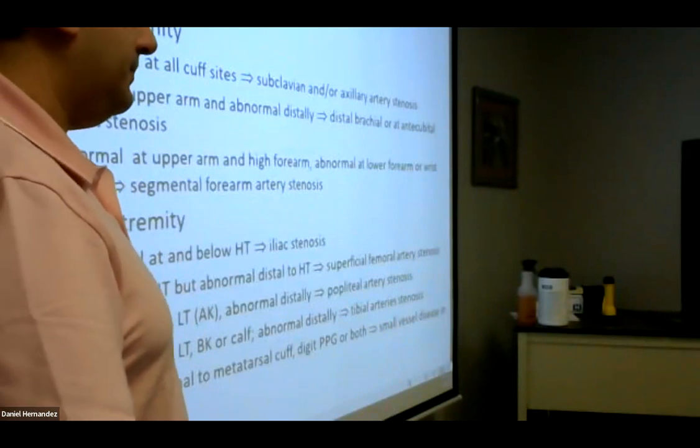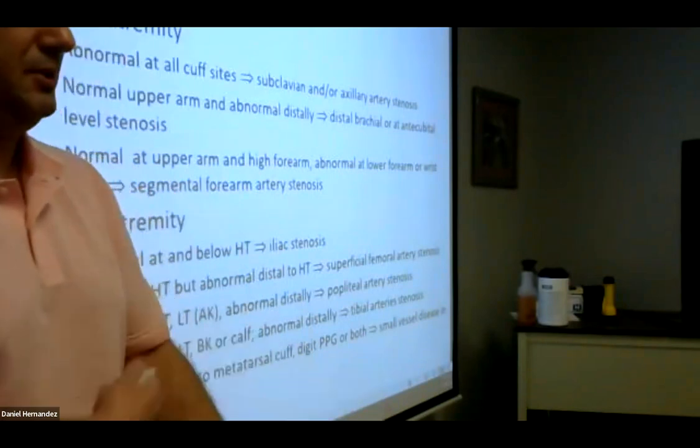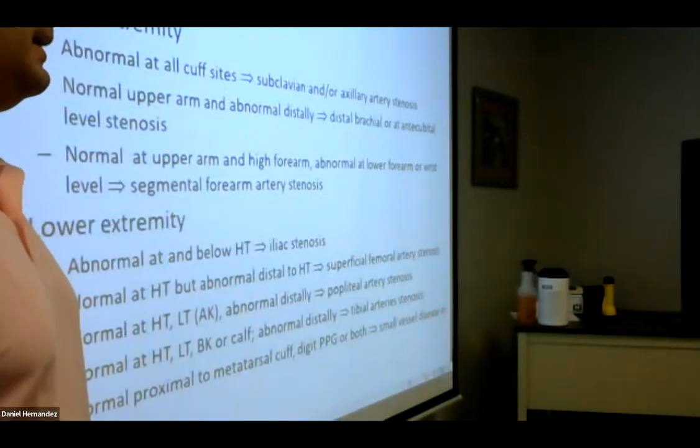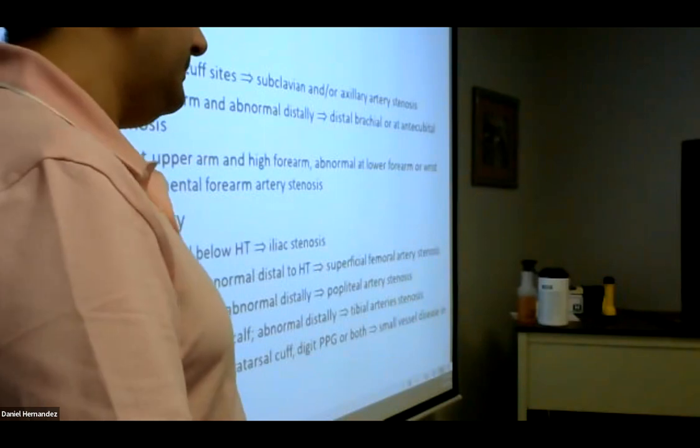I'm kind of weird about gross stuff. Sometimes I'll put a couple of chucks, but it can't be anything too thick or it could affect the measurement. I mean, you really want to get as accurate a measurement as possible.